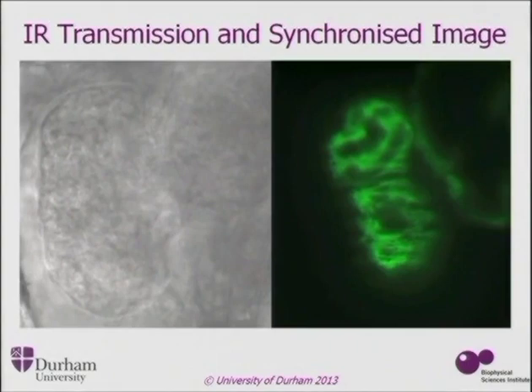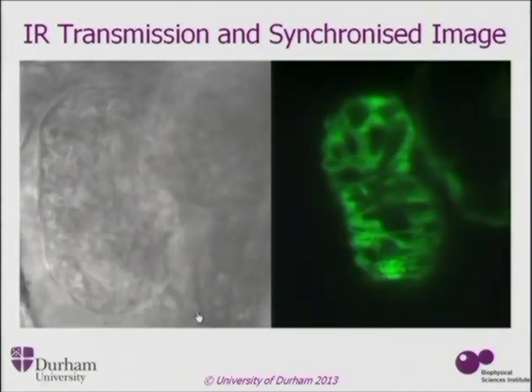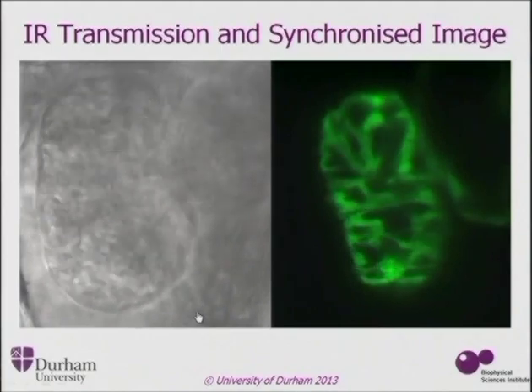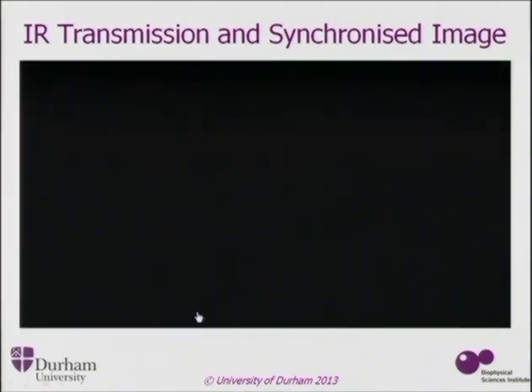Again, you'll see the beating heart, and then this is an optical section at one point, and you'll see the heart keeps on beating, and slowly the optical section changes as we take deeper and deeper images. So hopefully that will go on. You can see that this is about 200 microns right across here. So these are optical sections taken from that beating heart.